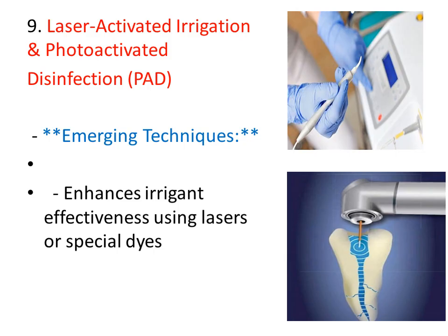This is an emerging technique which is still undergoing more use and more experiments, but it does give good results. It enhances the irrigant effectiveness using laser or special dyes which we inject inside the coronal pulp, crown pulp, or into the canals.